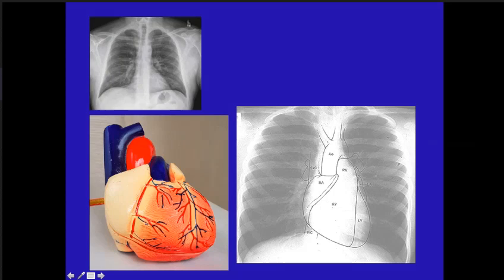Yes, sir. If you know that the normal right ventricle stops quite some distance from the left cardiac border, then if you have a chest X-ray today and a chest X-ray tomorrow and the lead has migrated to the left cardiac border, you would know that it is in the left ventricle. So that's the importance of knowing the surface anatomy. And this is a simple, straightforward frontal view.